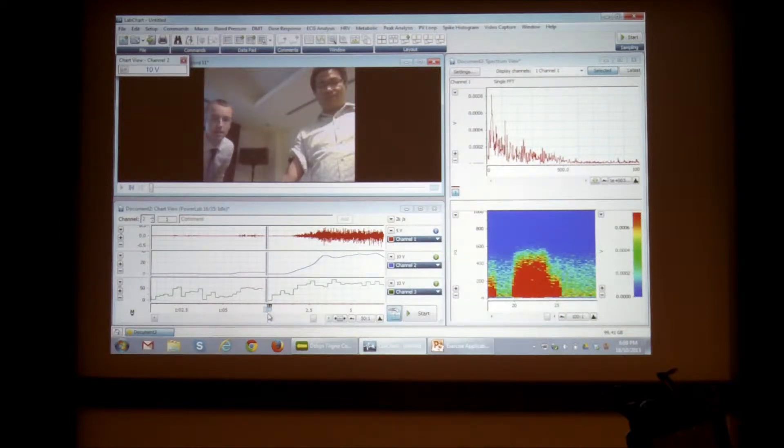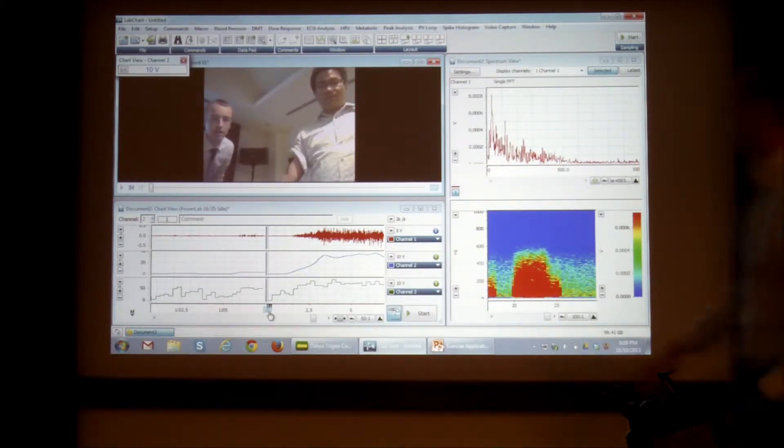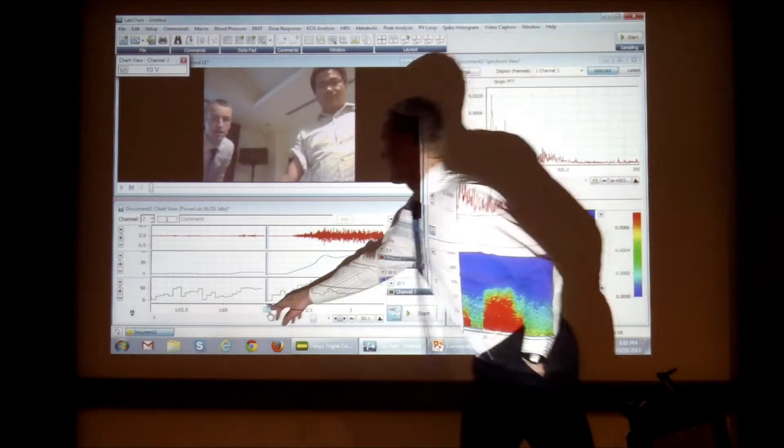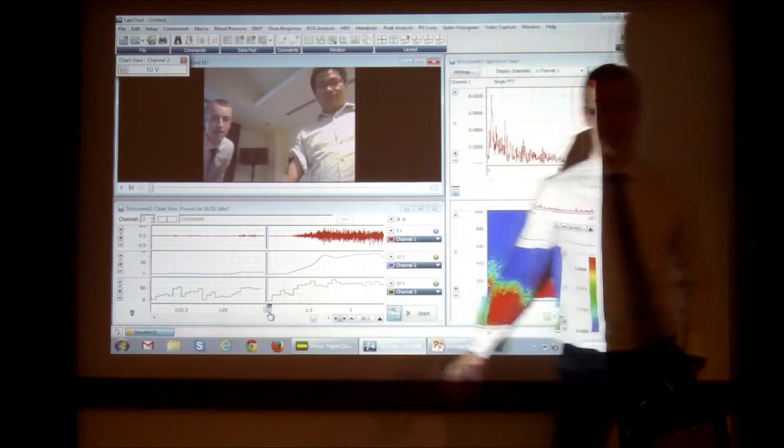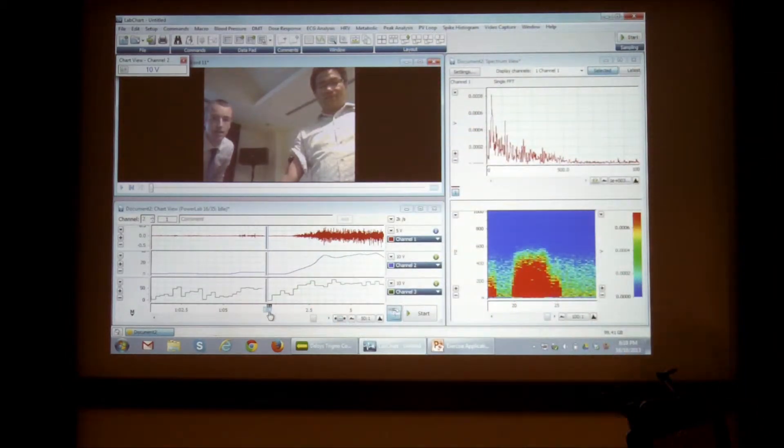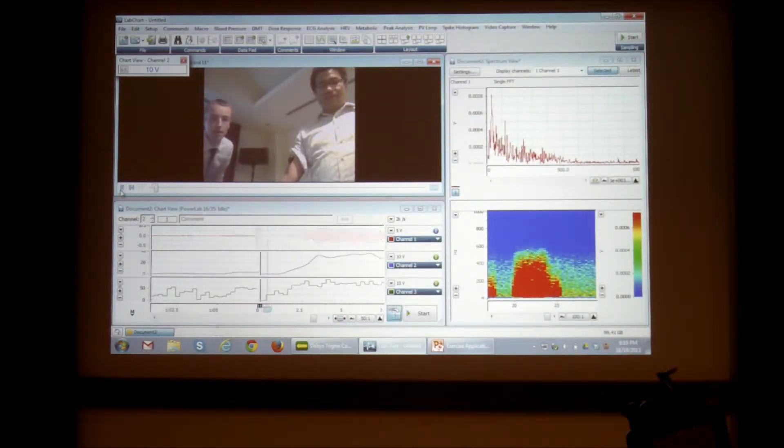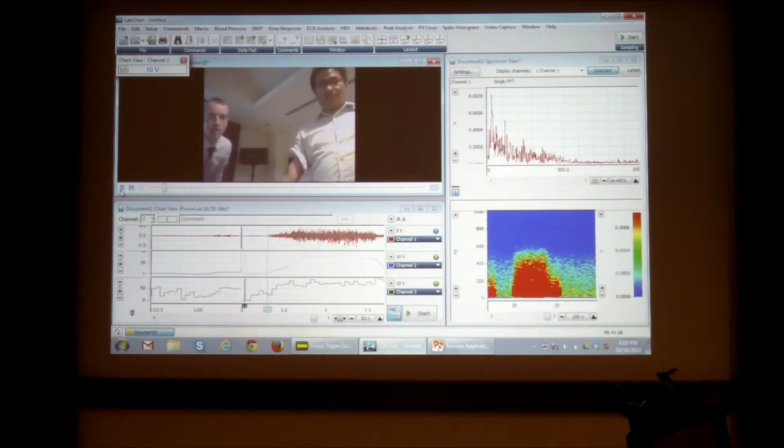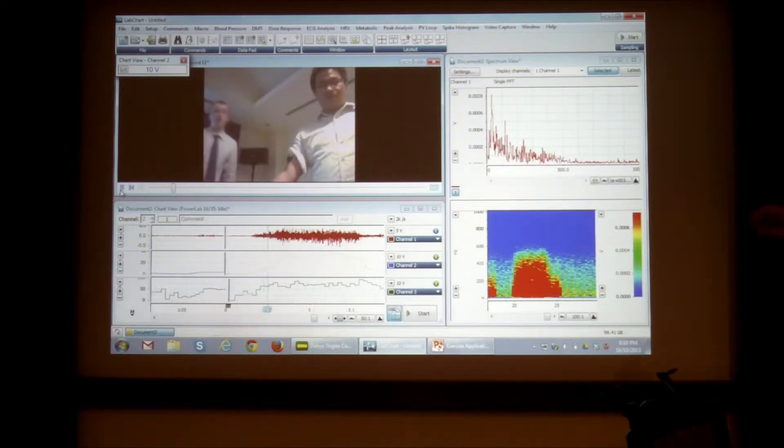So the start of the movie, which is this kind of little looping, has gone to the start of this recording. And now if I click play on the movie, it also plays back the data.